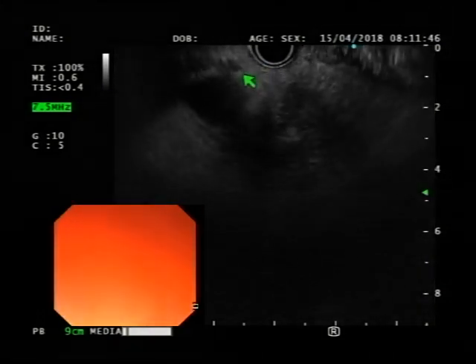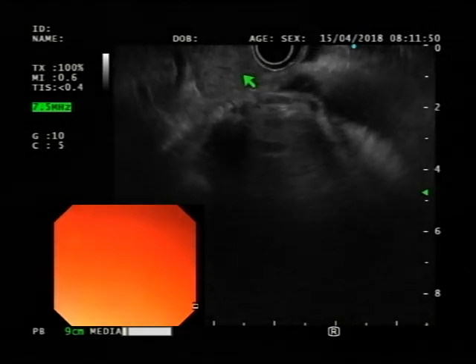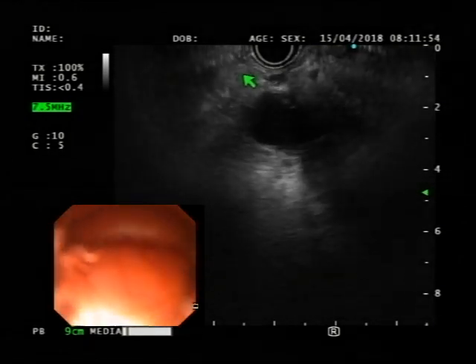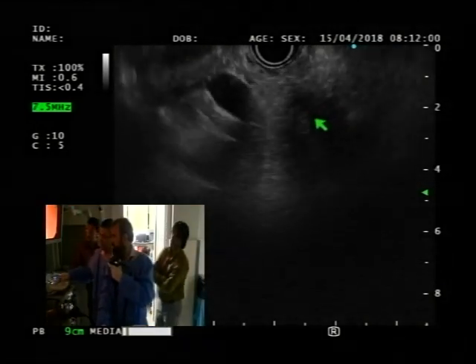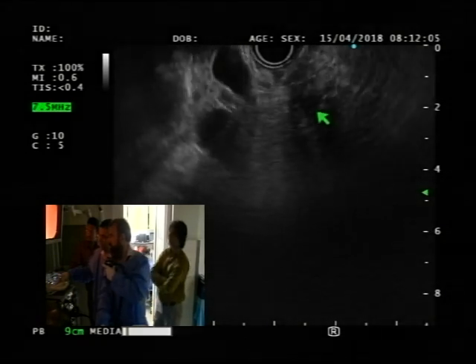Release the wheel a little further. Okay. That's a liver hilum, okay? Now go back there from there. Now let's try to find the pancreatic orifice when you go back there. Keep going, keep going. Keep moving towards the papilla, keep going. Big wheel towards you. Okay.